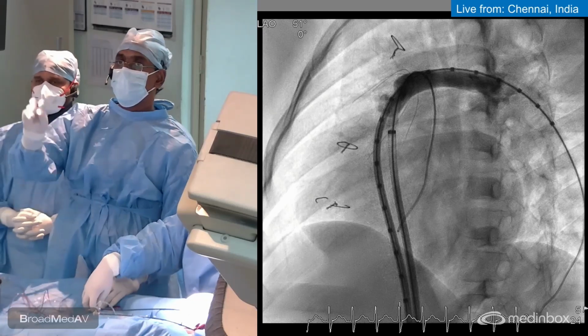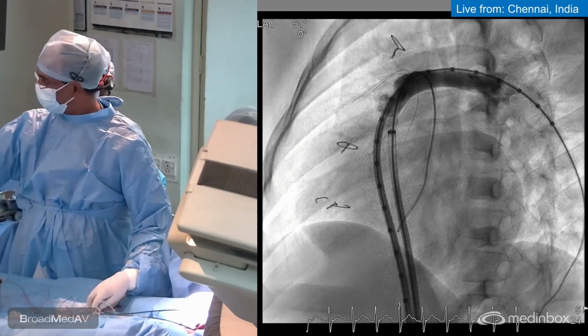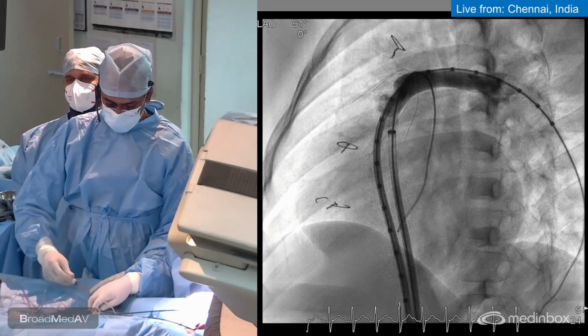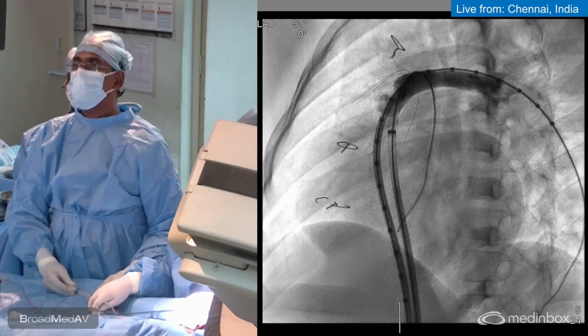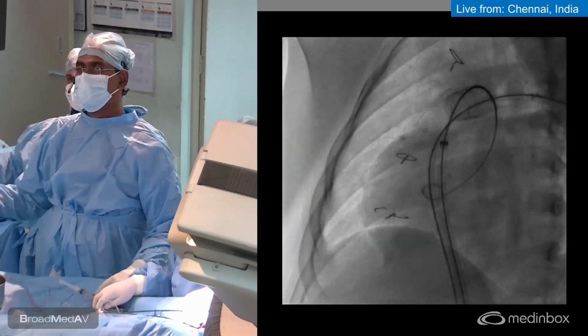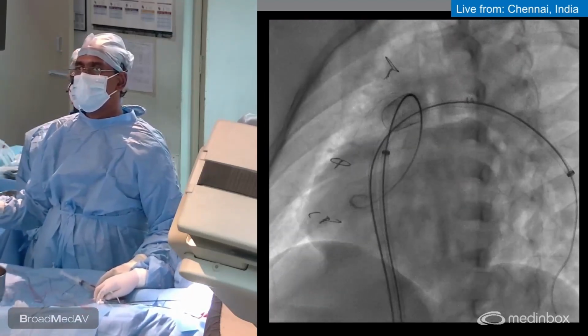So let's have a picture. This is LAO 51. Can we go to LAO 51? With the RPA stent, if you do an angiogram, it might give a better idea. With relation to the stent, we can see how far we have to come. Yeah. So let's lift the patient.